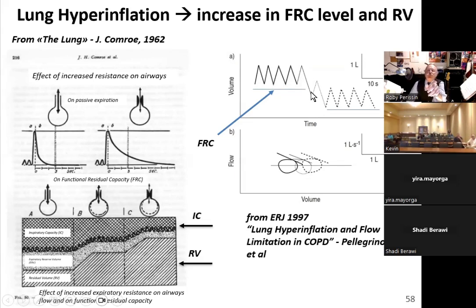So the purpose of your treatment is that the physician will prescribe drugs or non-invasive ventilation that actually lower the lung volumes and make the patient breathe more restfully. Of course, in these patients, as you well know, if you perform a slow vital capacity, the inspiratory capacity is reduced because they breathe at higher lung volumes. And therefore the residual volume measured by body box is increased.